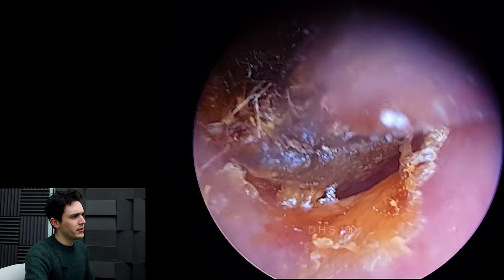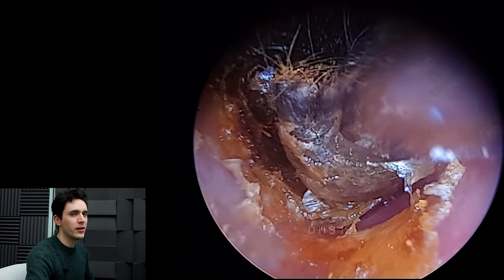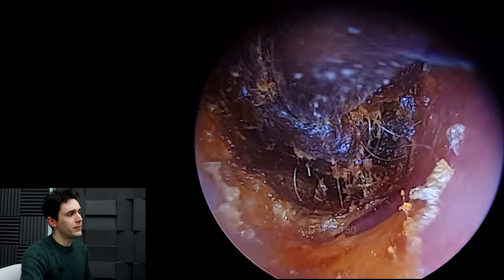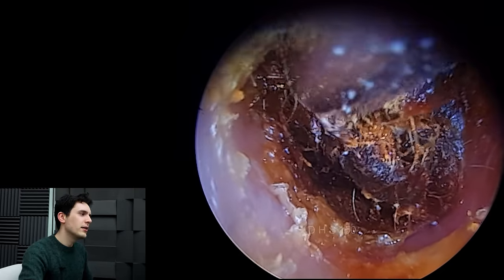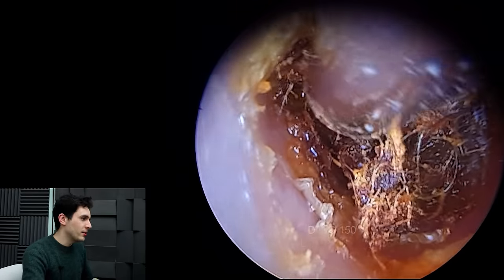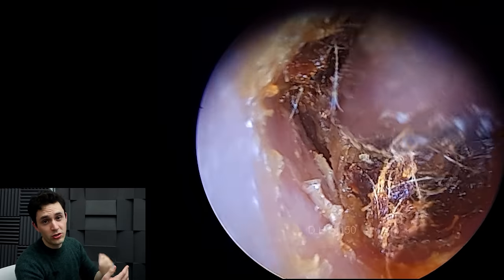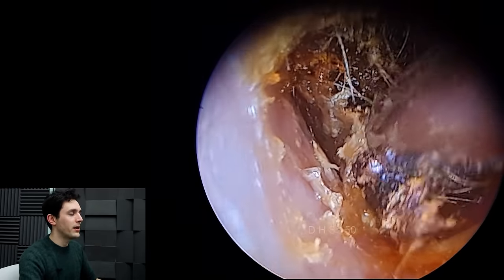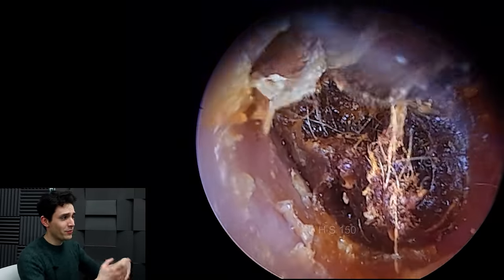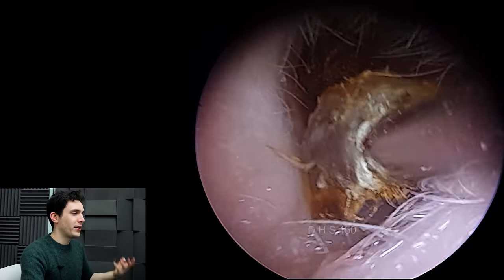So I don't think I've irrigated this side, but he's put in enough drops to make the debris a little bit more pliable, shall we say. The reason that this side is hurting is that his eardrum is really bruised. In comparison to bruises you get on the rest of your body, they're really, really tiny, but it's really sensitive down there. When it's on your eardrum and you've got loads of debris shoved up against the eardrum, it can be excruciatingly painful. So I'm just going slowly here, trying my best to pick apart this debris whilst trying to avoid the patient jumping out of his seat. So I'll just remove this debris here.